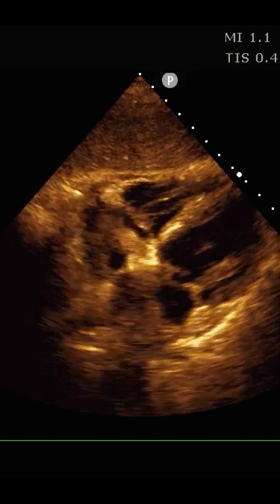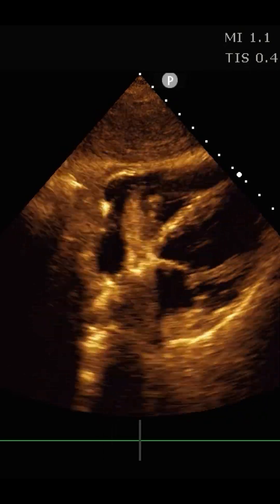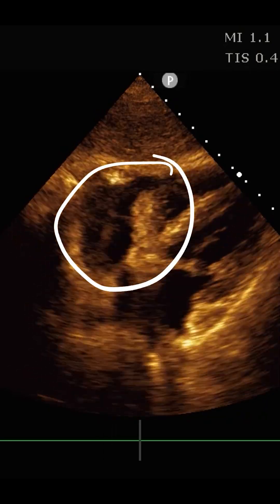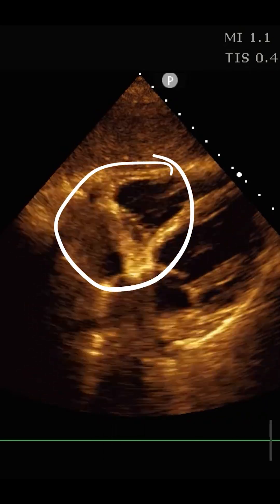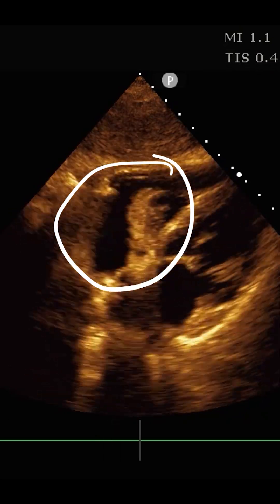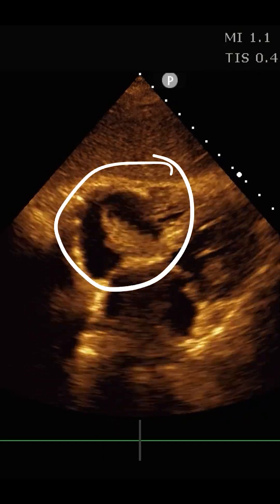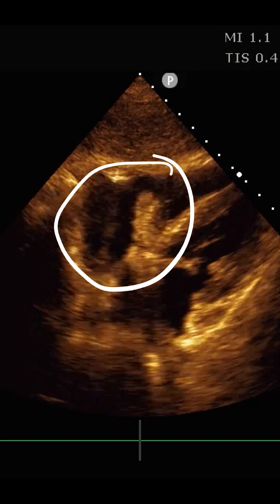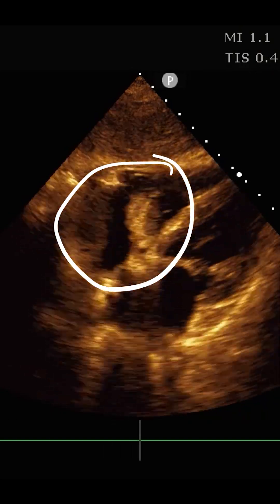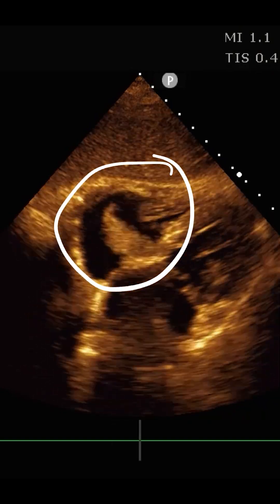In this clip, we see a mass lesion right here inside the right atrium. This brings up a differential diagnosis of about three broad categorical things. Number one: is it a thrombus in transit? Hopefully some of the clinical story will give us some help here.